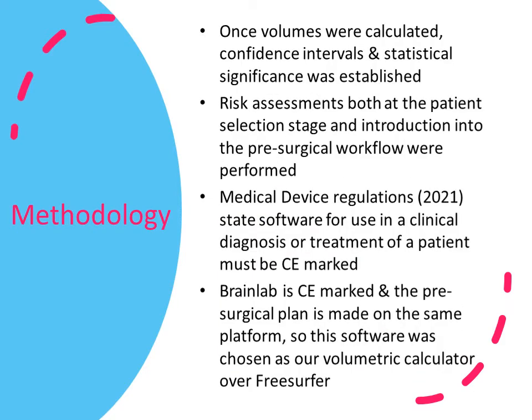Once the normal database was created, it yielded confidence intervals for each of our structures of interest. But in 2021, new medical device regulations came into effect in Ireland, and this meant that non-CE mark software could not be used in the clinical setting. This ultimately led to our decision to choose Brainlab Elements as our volume calculator, as FreeSurfer is open source.